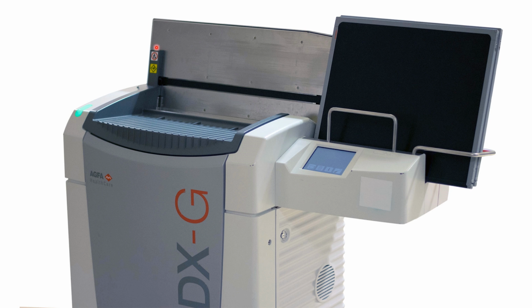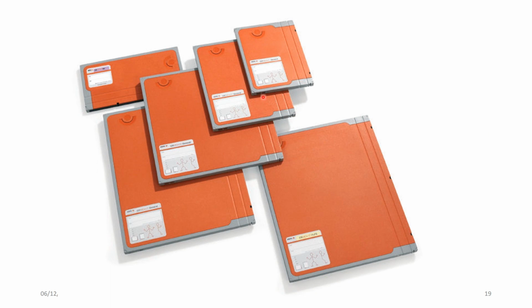And what happens is, this is the CR digitizer. And so you have this cassette here. You take a latent X-ray image, you expose a patient to radiation to take that image. You have a latent image on here, which needs to be read and digitized. You pop it in there. It takes the cassette down into here, reads it, and fires it back up into the cassette and pushes it back out here. All takes about 20 to 30 seconds. And then it sends it to wherever you've tagged it to, because you have to tag it with the patient information so it makes sure that X-ray is tied to the correct patient when it's been digitized.